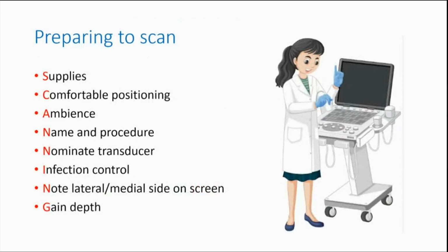So there are some points that we need to take note of when we prepare ourselves to scan a structure. This can often be remembered by the mnemonic SCANNING, which stands for supplies. We have to ensure there's adequate equipment, supplies, comfortable positioning of the patient, the correct ambience, identify the patient and the procedure to be done correctly, transducer, nominate the transducer, and this procedure should be performed under aseptic techniques.